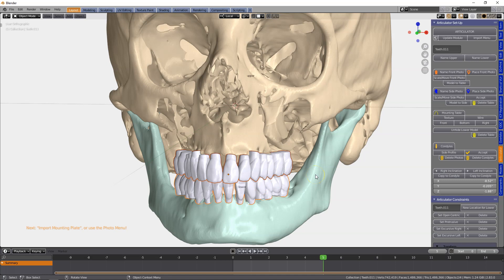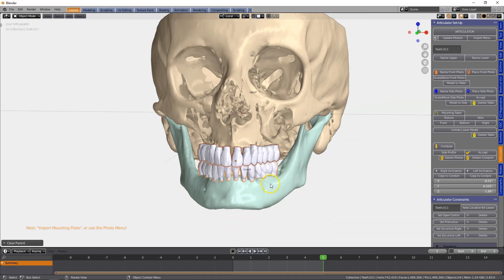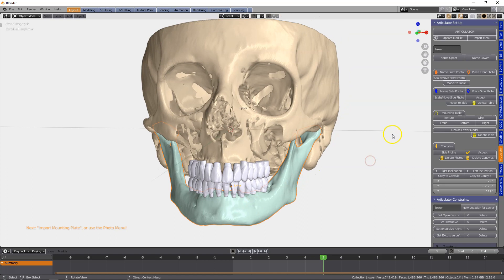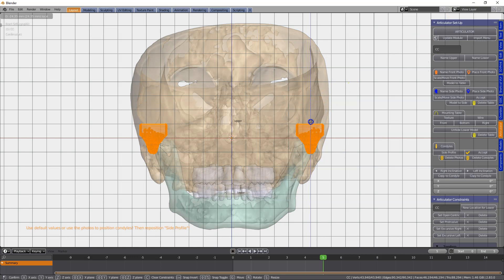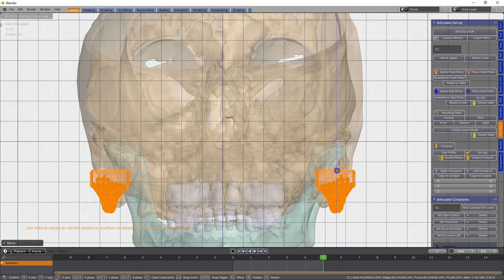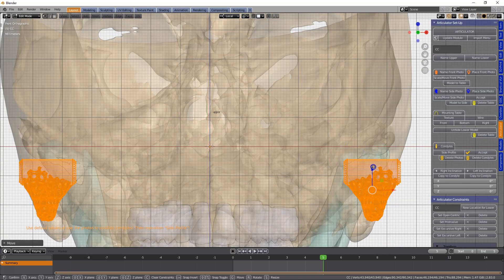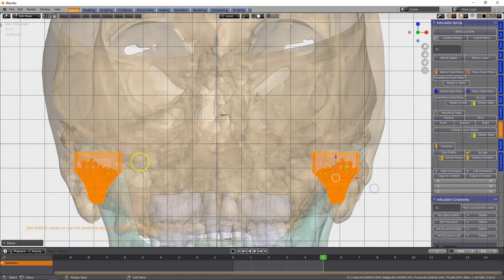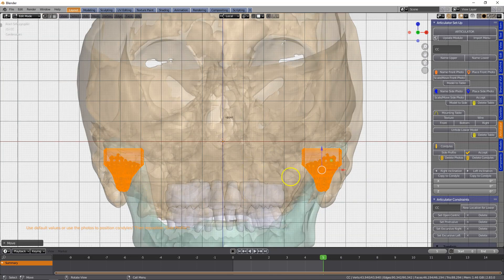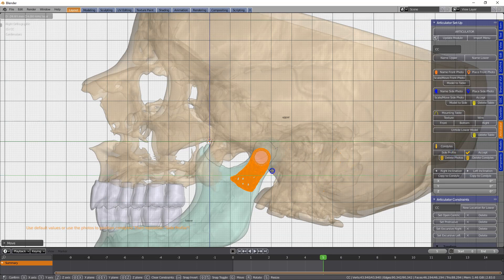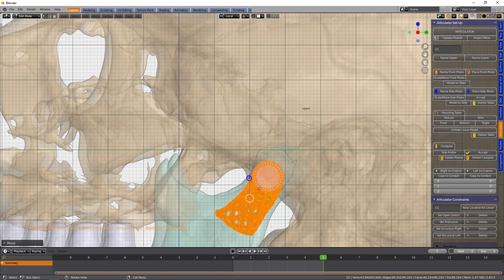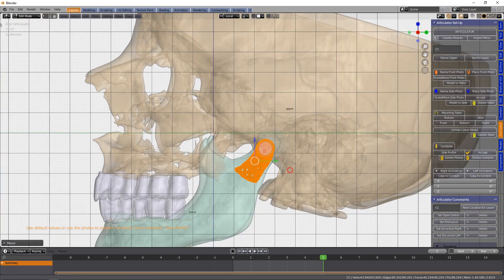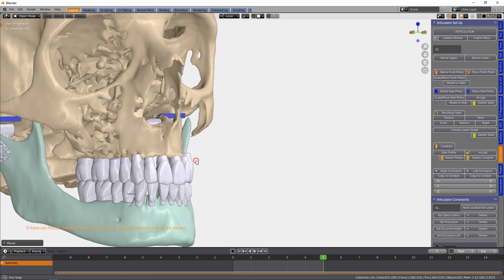I will un-parent these teeth and then we can bring in the condyles. Here I'm going to move them down and across a little bit, and then view it from the side and accept it.